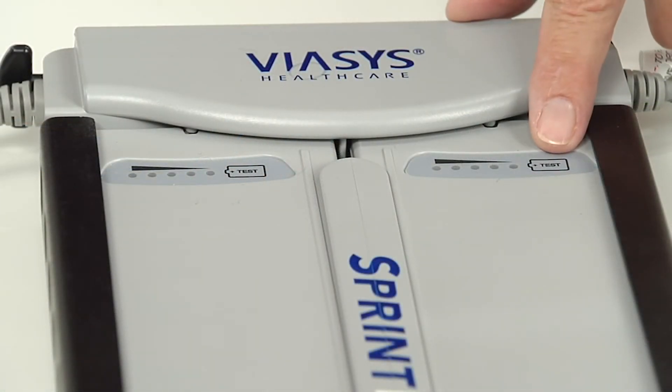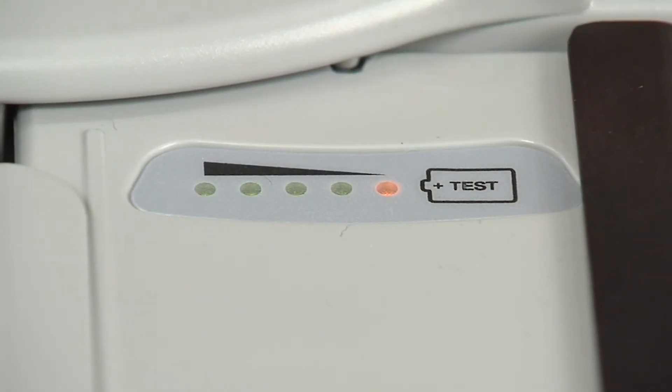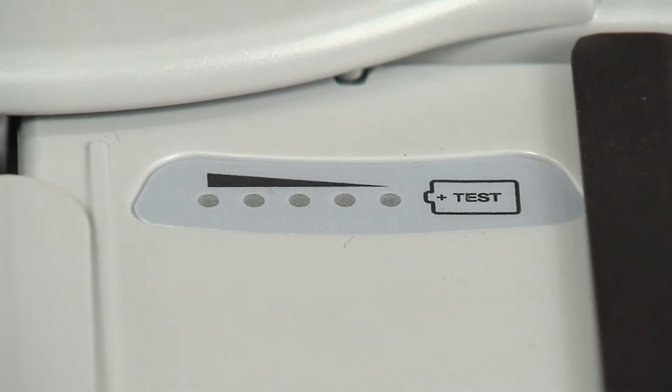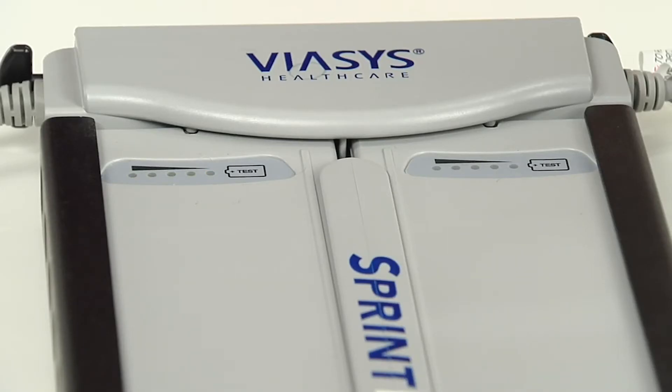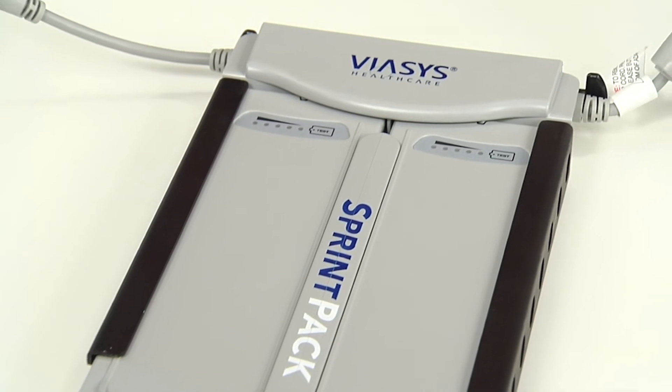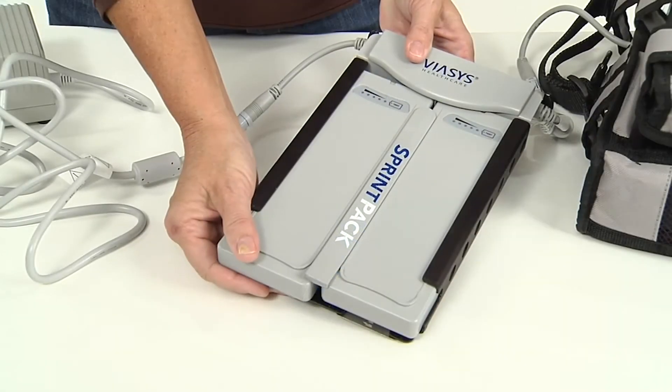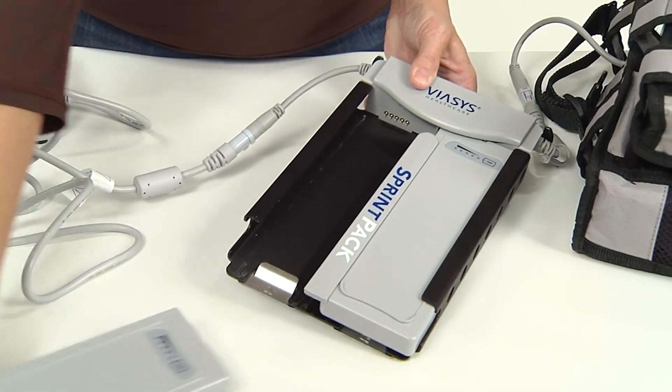The lighted power supply indicators on the front of the Sprint pack battery cells show how much battery power remains in each cell. A complete charge will show five dots lit. Fully charged Sprint packs will provide the LTV 1200 with power for about four to five hours on nominal settings.